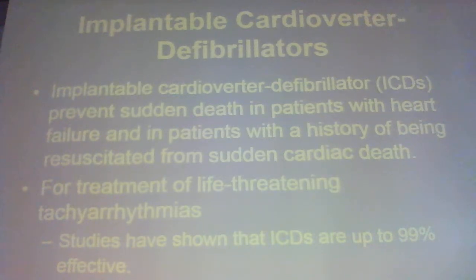You said it was at 80 milliamps? Yeah. I mean, that's only double what you're pacing. Yeah, but this is directly attached to your heart muscle. Right. But I'm just saying, that makes me nervous now to touch anybody that's pacing. You could feel it. Interesting. I mean, we used to pace asystole and we did CPR in between your pads. Yeah, 80 milliamps isn't very high. Yeah, I mean, most of the time you're talking less than 1 milliamp is what they're set at. So 80 milliamps was a ton of electricity.